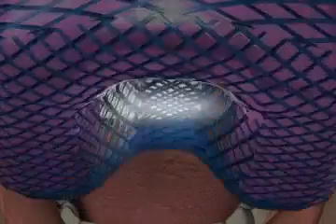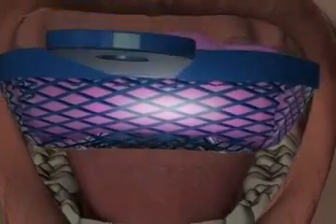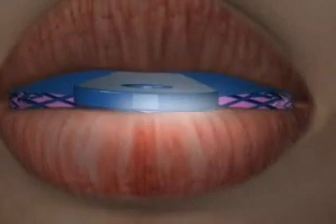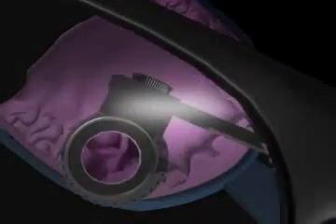The term impression flaws is an umbrella term referring to all unwanted complications that may arise when dental impressions are taken. The impression is the basis for your dental prosthesis. Mistakes that occur during this step of the procedure will inevitably lead to an ill-fitting prosthesis. Here you see a brief summary of the work steps involved after the impression has been taken.